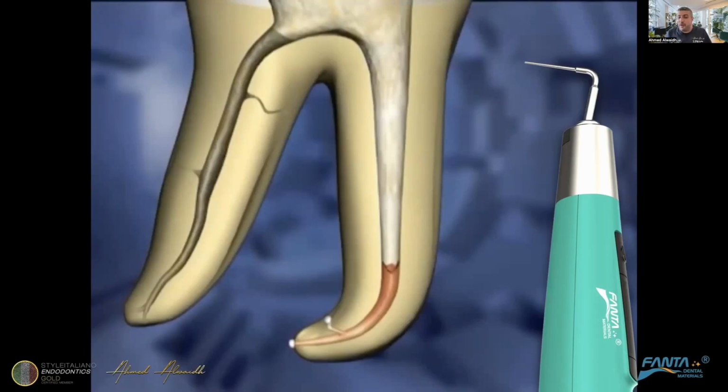So now we have a 3-dimensional obturation of the apical third, which is the most important part of the root canal system. Why? Because the majority of anastomoses, lateral canals, and fins are there. The more complexities are in the apical third, and this is what is important.